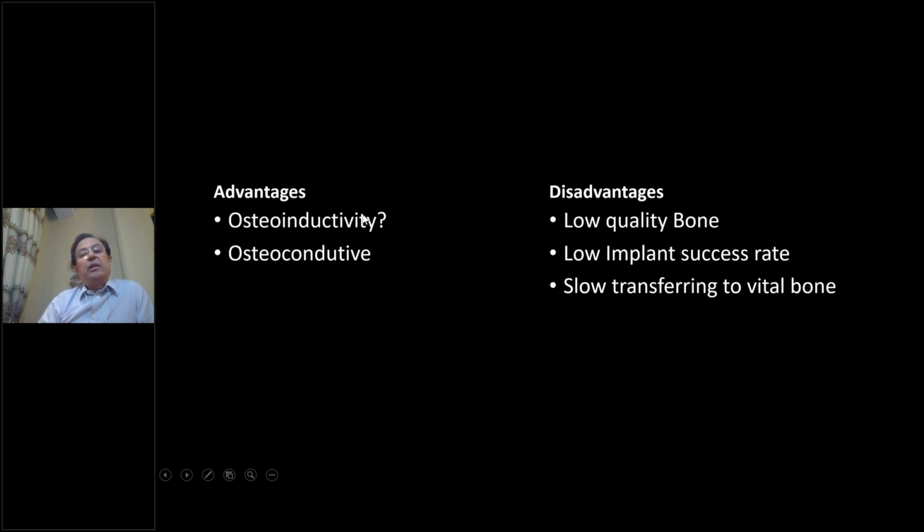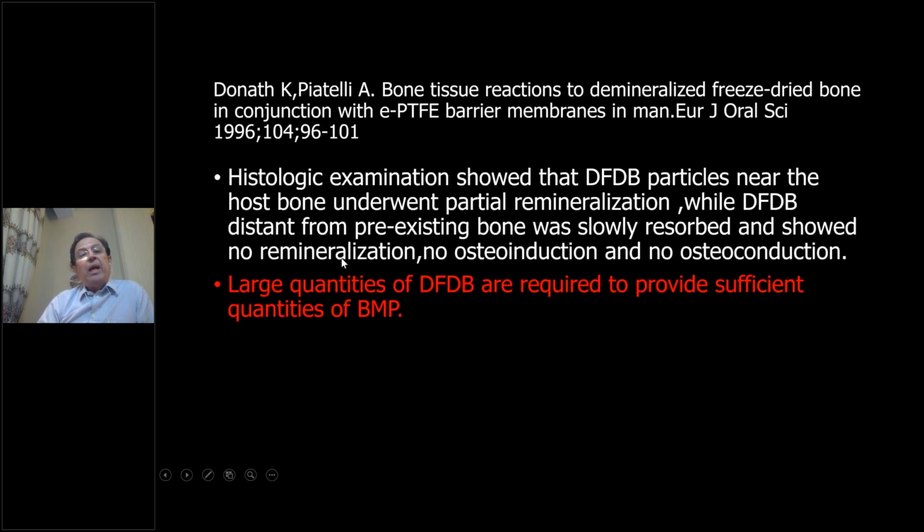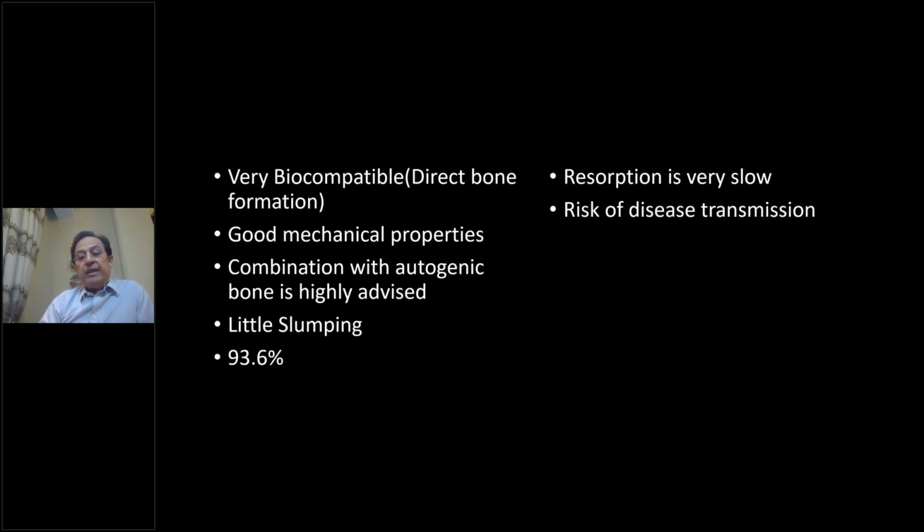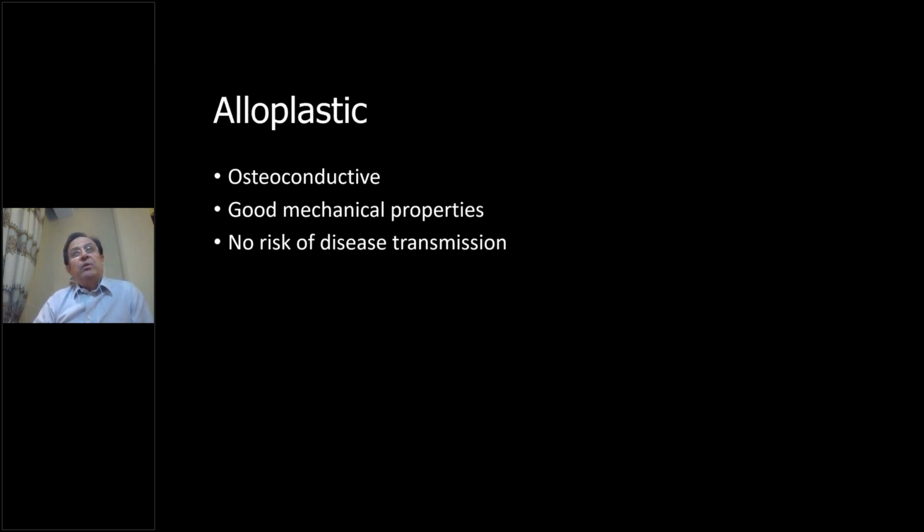and there is a lot of doubt about their osteoinductivity, and today most of the papers believe that they are osteoconductive. And xenografts were and are very successful in sinus graft, and also alloplastic.